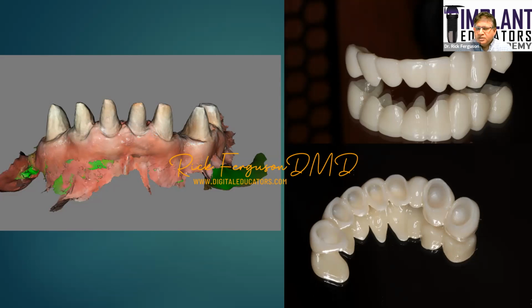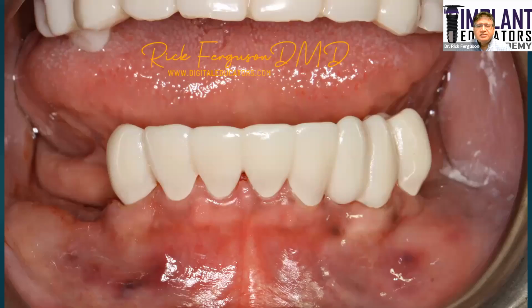With this particular resin, you don't actually wash it in an isopropyl alcohol wash. You just wipe off the resin, blow out the inside with some compressed air, and then you can put a glaze on it if you wish, or you can polish it using buffing wheels. I did put a glaze on this, but basically this is the best type of temporary you're going to get. You're able to cement this directly to the prep teeth, so the tissue health and so on is going to be great. And of course, my assistant loved it because she didn't have to reline and trim out the temporary.